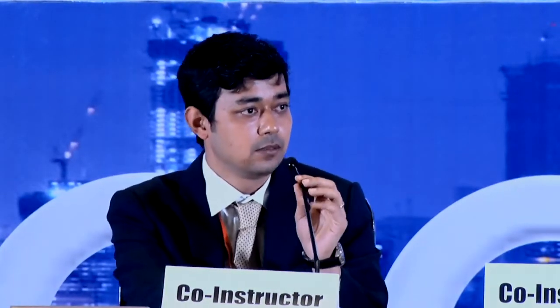Sir, you showed some videos where there was a large PPC with a significant amount of nuclear sclerosis as well. So in those situations where we really can't do a good hydro and cannot rotate the nucleus, what would be the techniques that you'd follow to remove the nucleus safely?